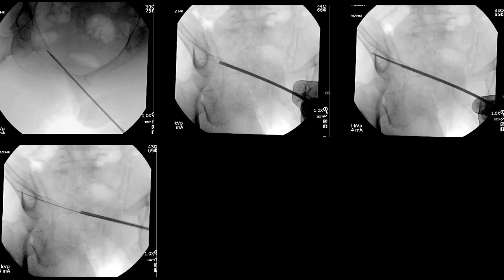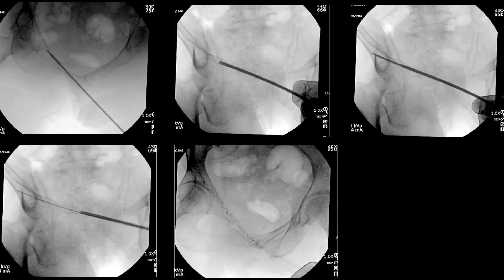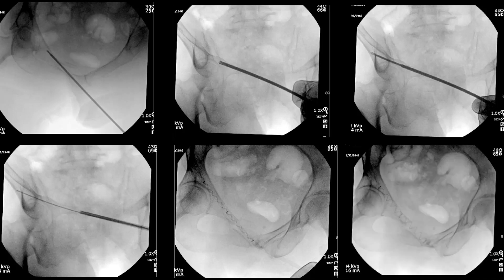I can then use the Luminos flexible reamers if needed, followed by application of the sleeve and insertion of the implant. This is what it looks like when it's put in and not yet inflated. As you eject the monomer it fills the space, occupying the gap in the intramedullary part of the bone.